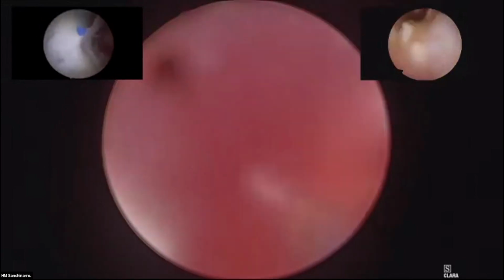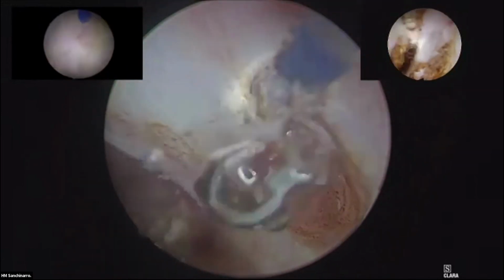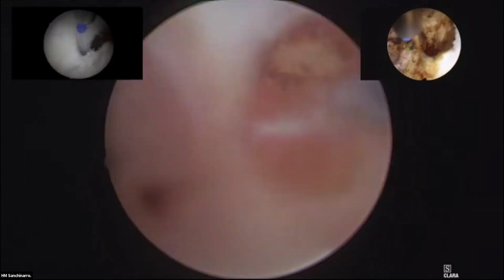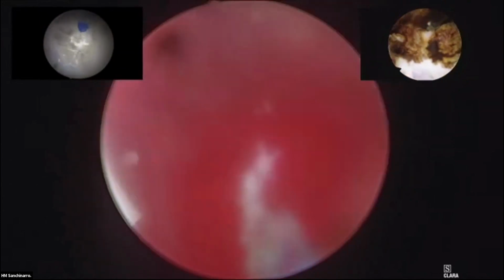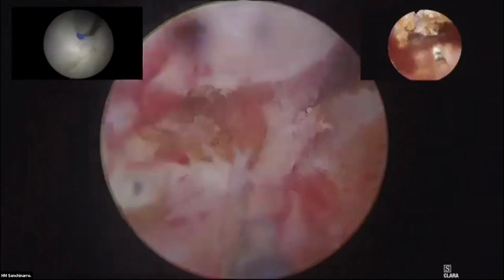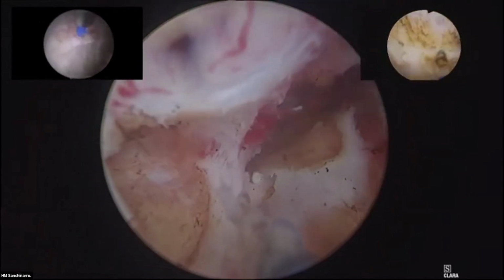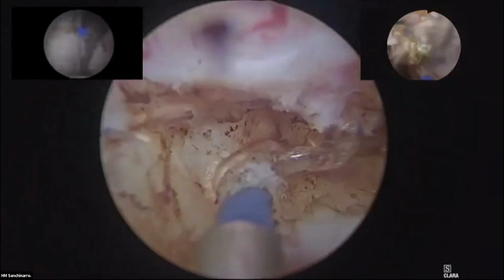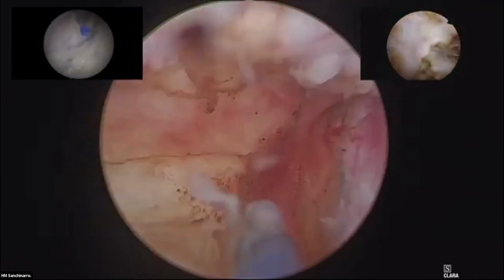Okay. Now. So I've already enucleated the left lobe. The first. Yeah, the first or the second, if we think that the first was the third. You usually perform one side before the other, or you choose to start with one side or the other side, depending on the anatomy? Or no, it depends on the fact that I'm right-handed, and for my position, it's better to start on the left. And then I go to the right.